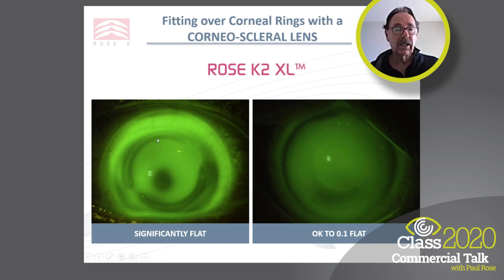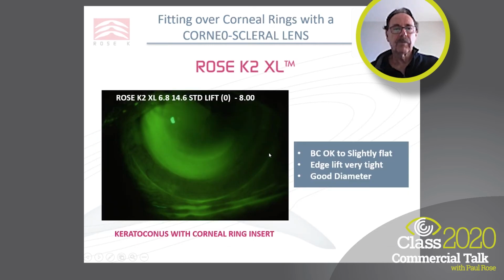This is definitely flat. That would cause binding to the cornea and cause significant staining, both centrally here and over the rings. This is not too bad, but we've still got a slight touch over the ring position here. I would want to go 0.1 steeper than that.